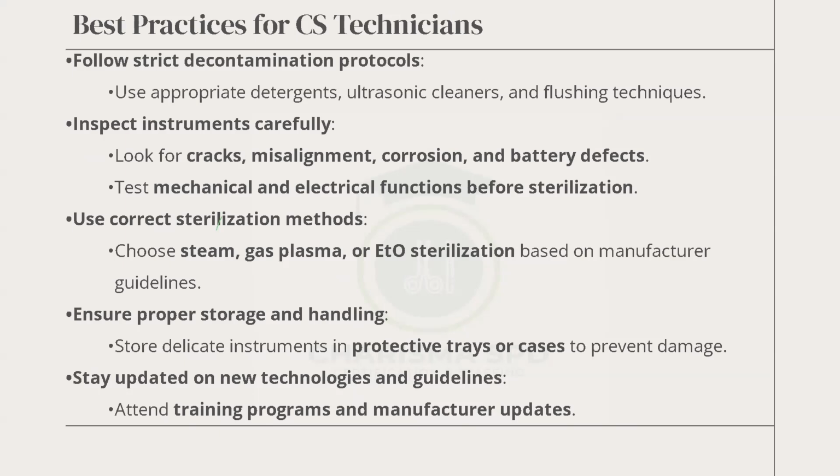Best practices for CS technician. Follow strict decontamination protocols. The word is strict. Follow strict decontamination protocols. The items, you go there, decontamination protocol, dress well, soak, brush, flush, sonic if need be. Don't cut corners. Don't just put it under running water and put it by the window and say it is done. No.